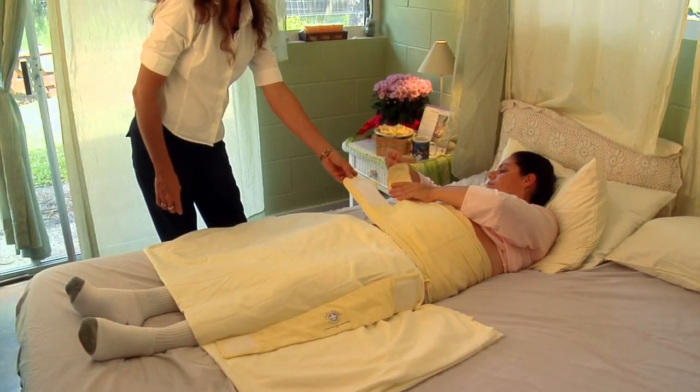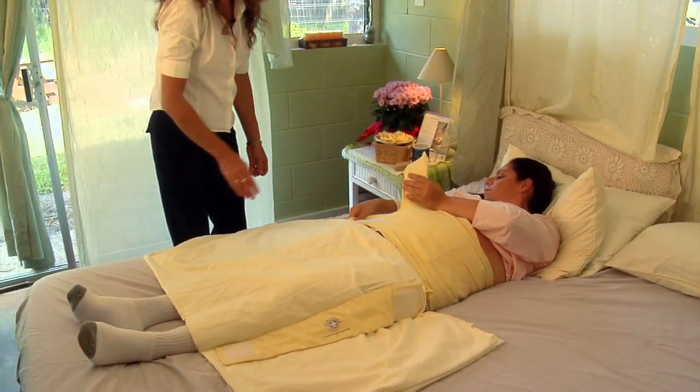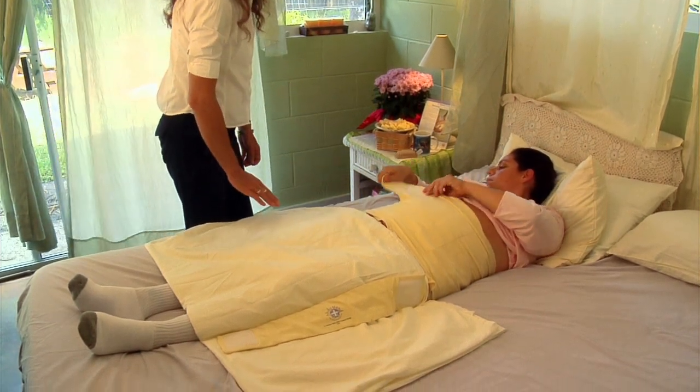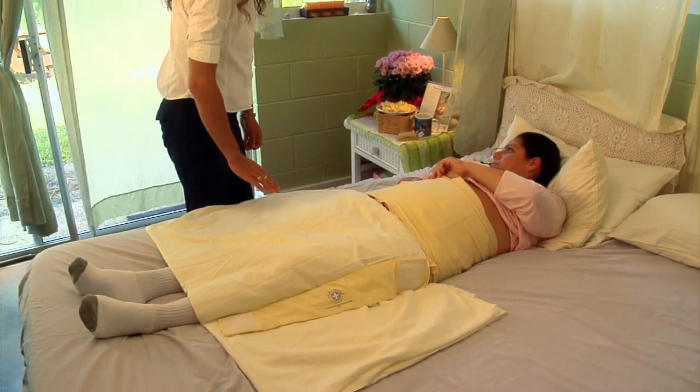Bottom strap first. That's right. Secure that bottom strap first over the incision, and then do the top strap as you like.